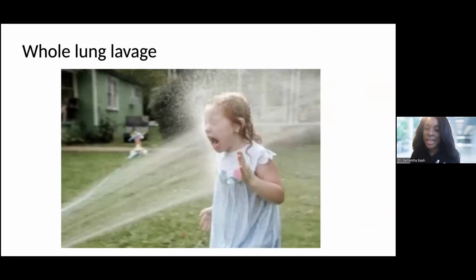So when my patient came to get his procedure done, he said, "Dr. Ba, are you going to power wash my lungs?" And I said, "Absolutely." So this is basically, we inject a whole bunch of saline in the lungs and we shock the alveoli and we get all that junk, that surfactant, the protein and fat content out of there.